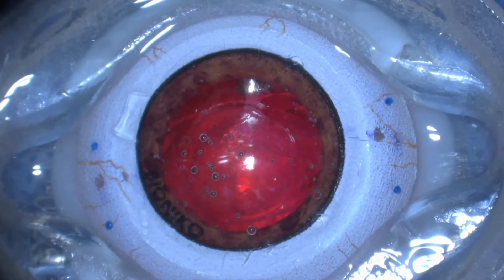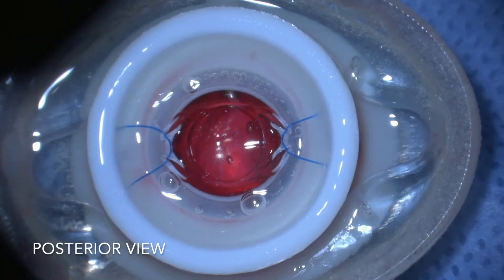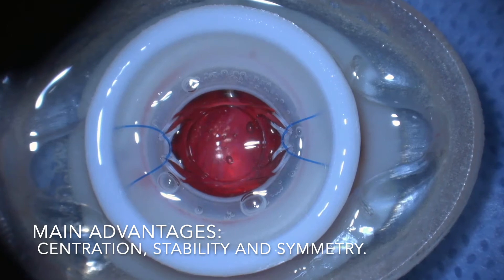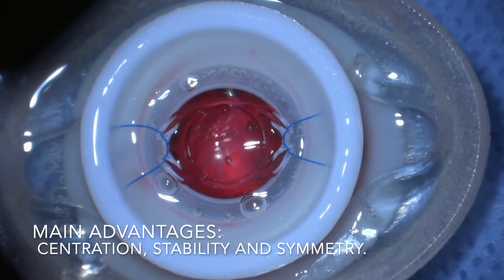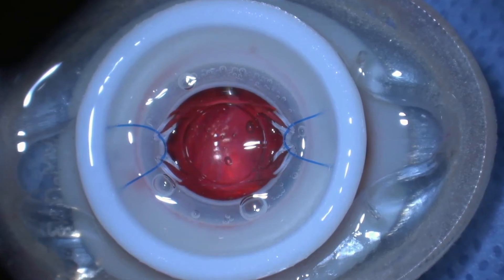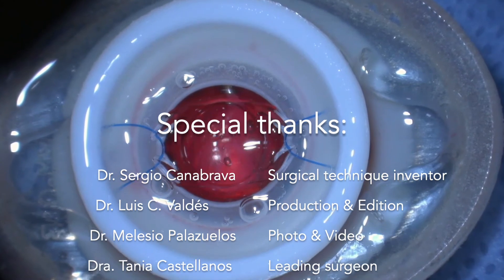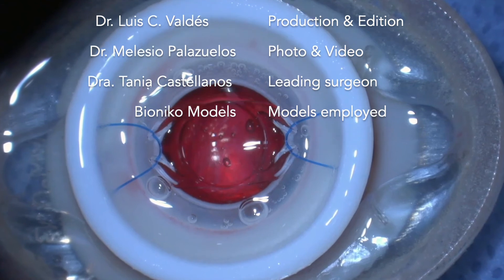Final result. Here, on the posterior view, we can appreciate the excellent centration, stability, and symmetry that can be achieved with this technique.